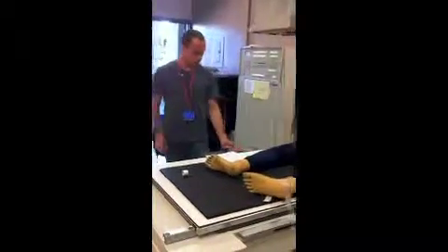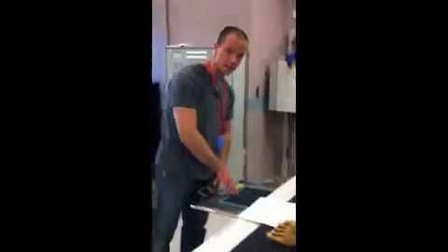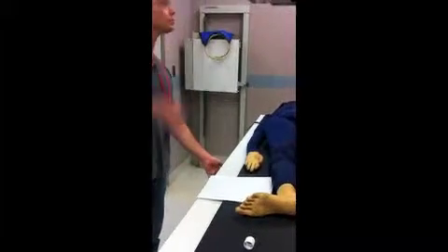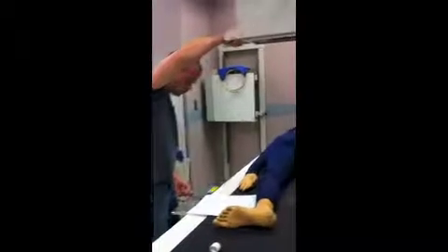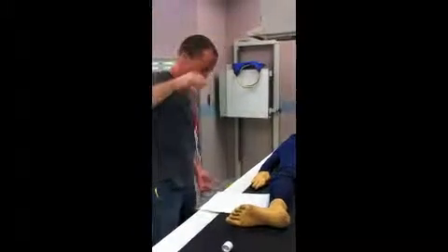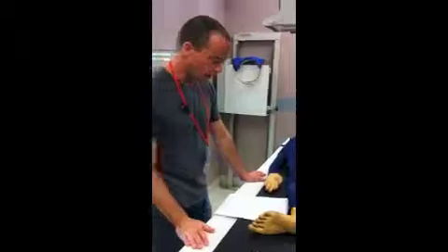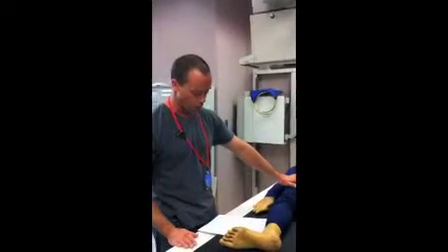The plate we have in goes crosswise. The film goes in crosswise, and again, the patient is supine or prone, preferably prone.